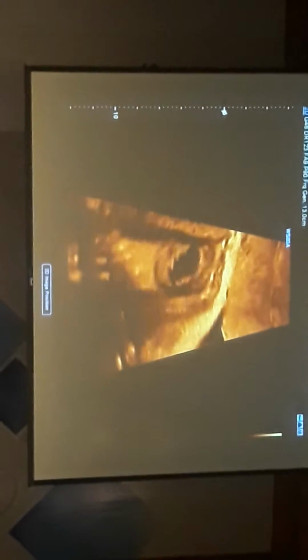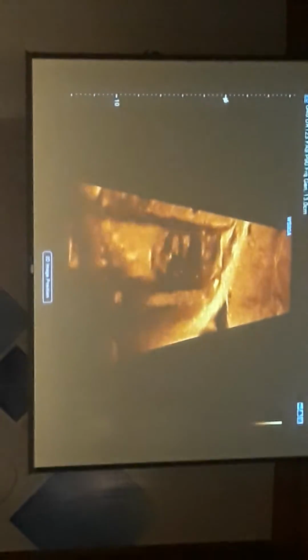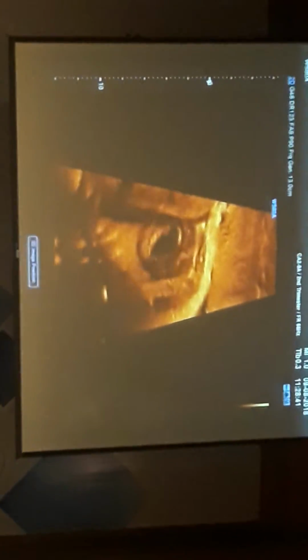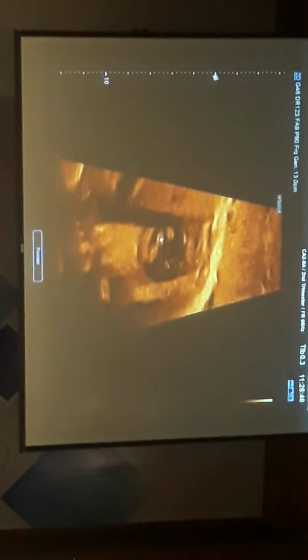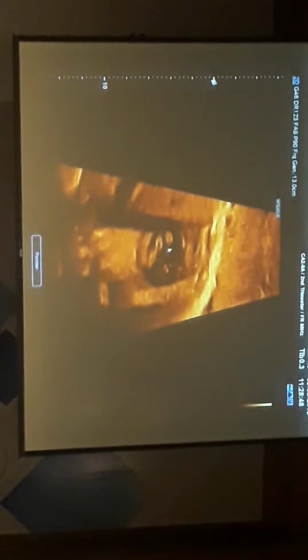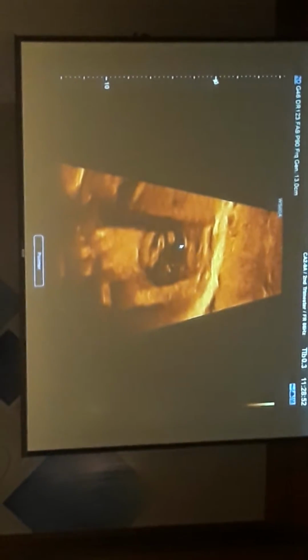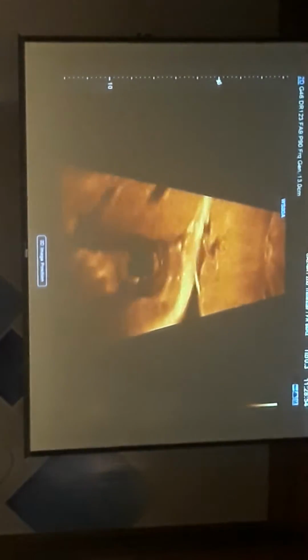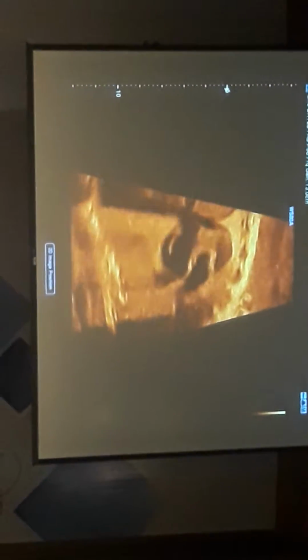Looks like one big ventricle. And the valve does not touch the septum. It seems like it comes to a couple of papillary muscles here, but nothing touching the septum, so it makes me think this is a mitral valve with tricuspid atresia.